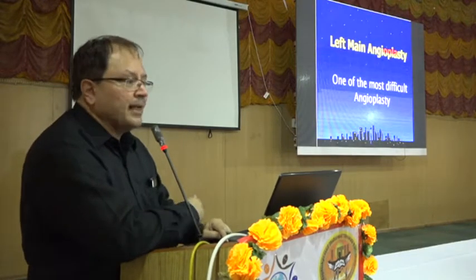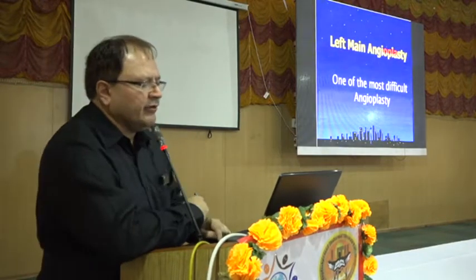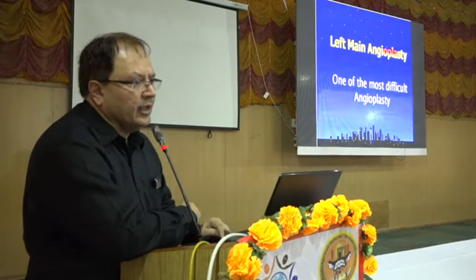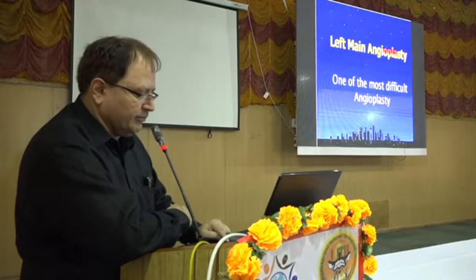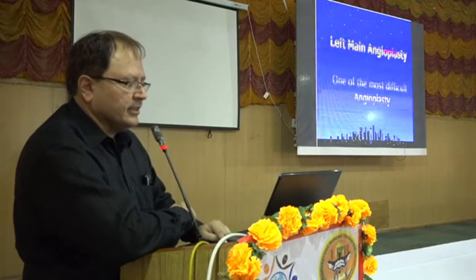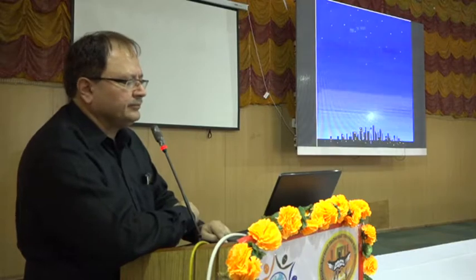What about left main angioplasty? Again, left main angioplasty is very, very difficult to do, and all left main angioplasty should be done under cover of IVUS. Make a point of that: under cover of IVUS. So I'll tell you an example.